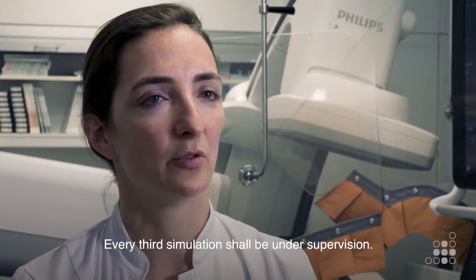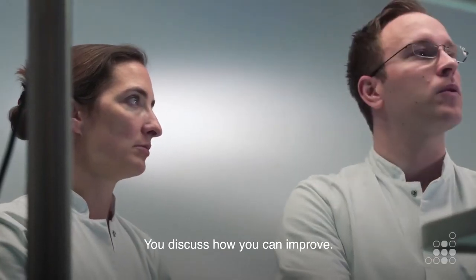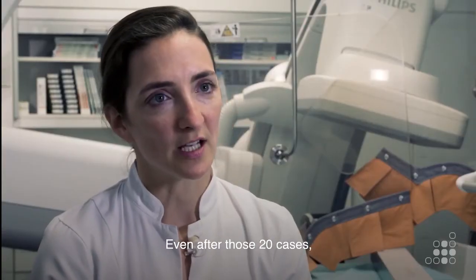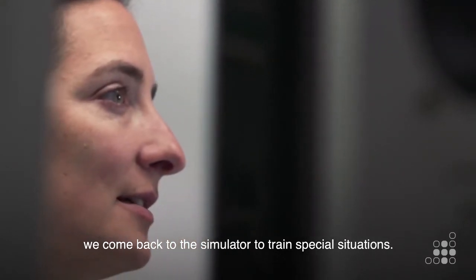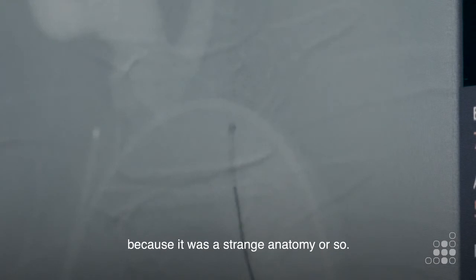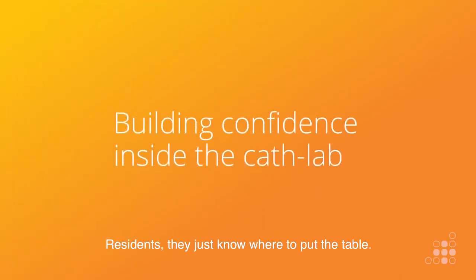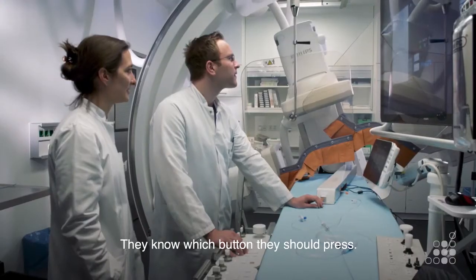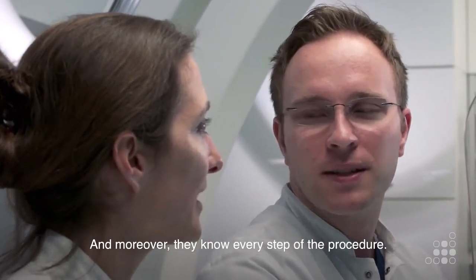Every third simulation shall be under supervision. You discuss how you can improve and what you should do better next time. Even after those 20 cases, we come back to the simulator to train special situations, or to train a real case which we did the day before because it had a strange anatomy or so. Residents just know where to put the table, they know which button to press, and moreover, they know every step of the procedure.